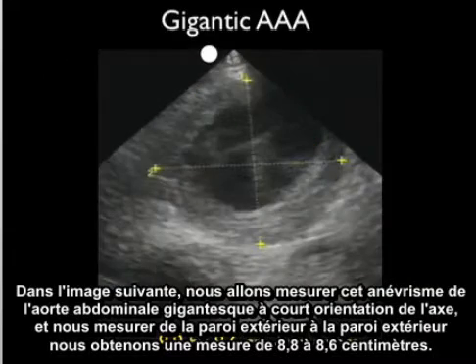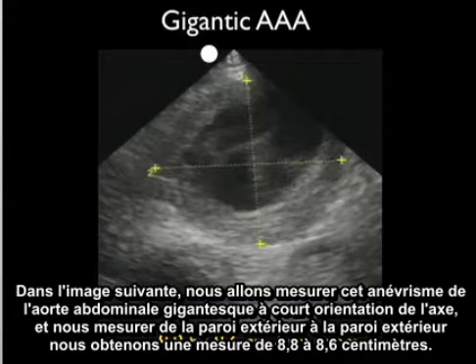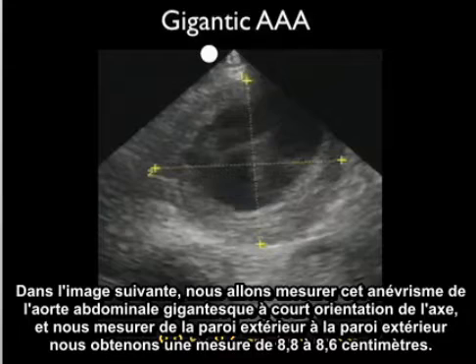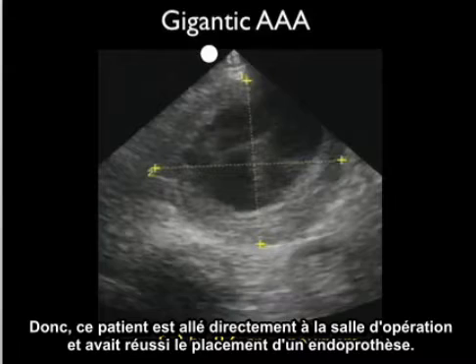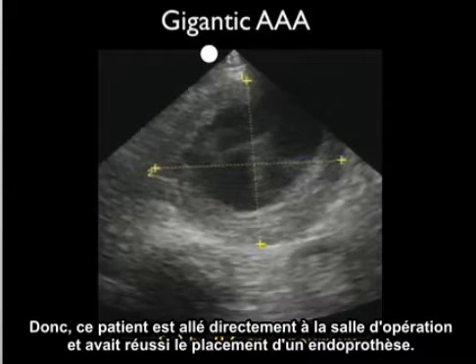In the next image we're going to measure this gigantic abdominal aortic aneurysm in the short axis orientation, measuring from outer wall to outer wall. We get a measurement of 8.8 by 8.6 centimeters. This patient went directly to the operating room and had successful placement of a stent.